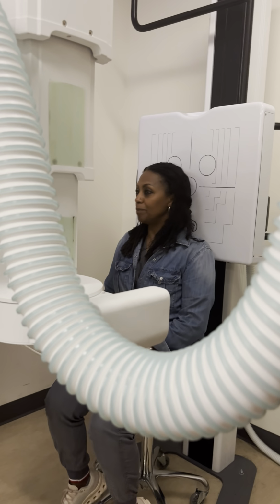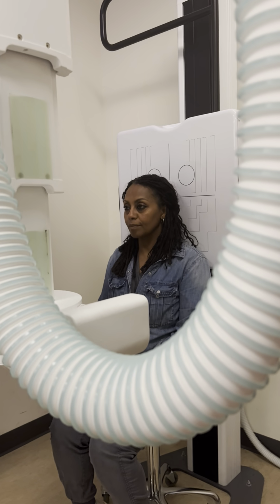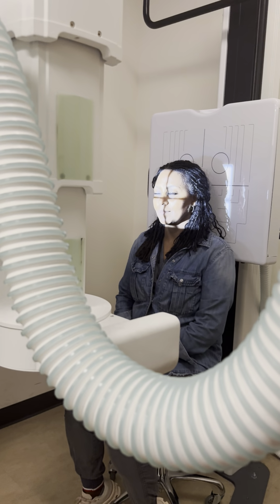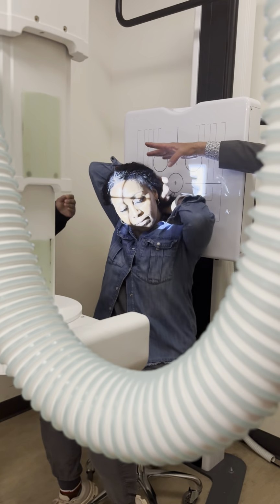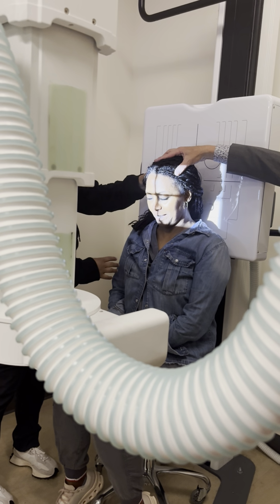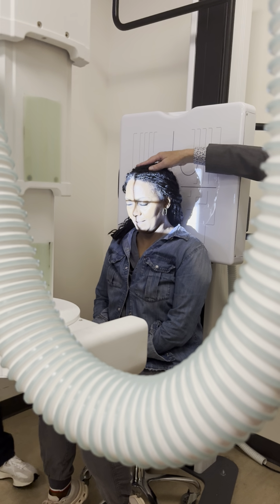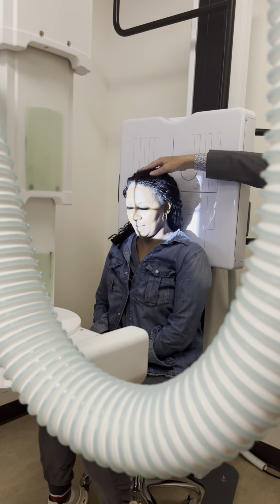Cool. So an AP projection of the skull involves setting it up such that we are at the nasion with the OML line. And with Yogi, it involves tucking your chin quite a bit. Outer canthus to that ear hole is where we are with it, right in the middle. And we're just going to meet right in the middle of her nasion, between the eyes.